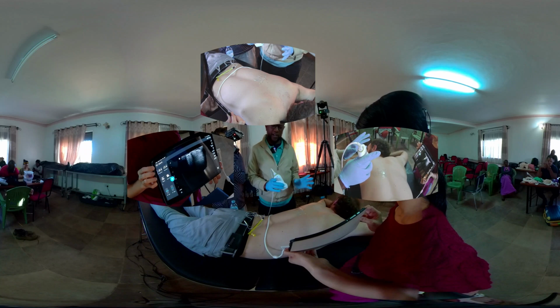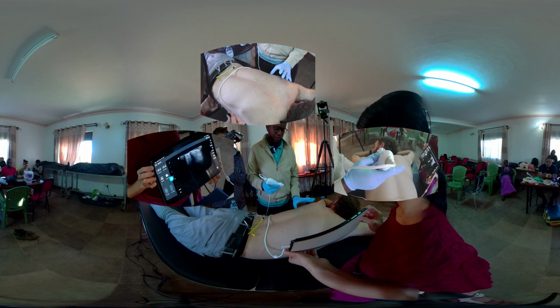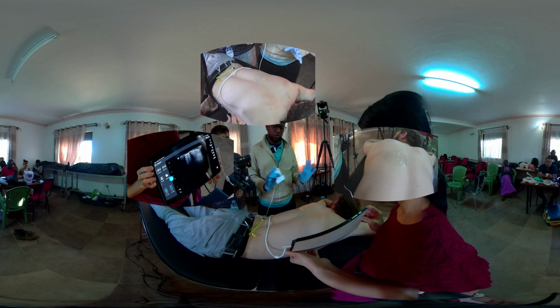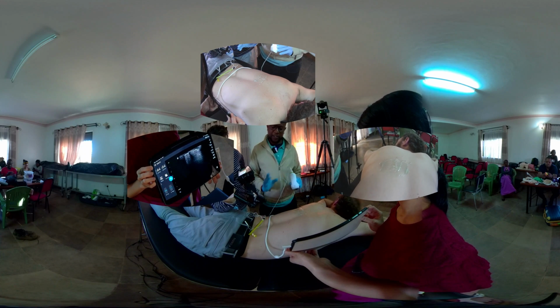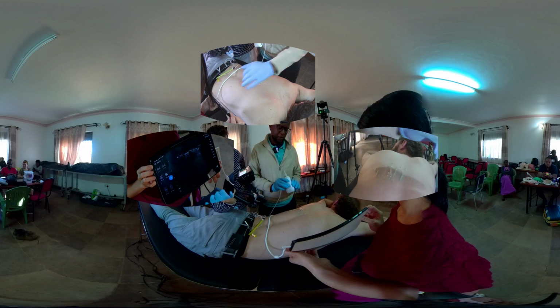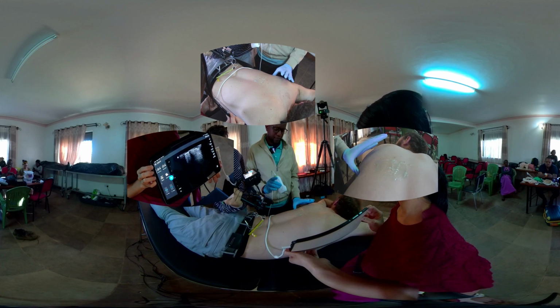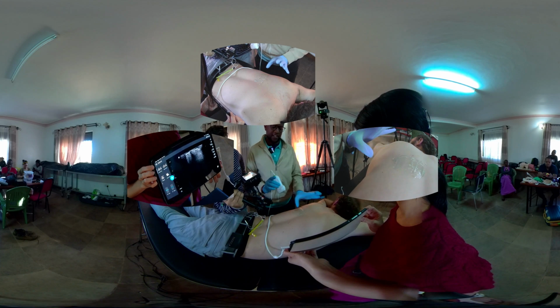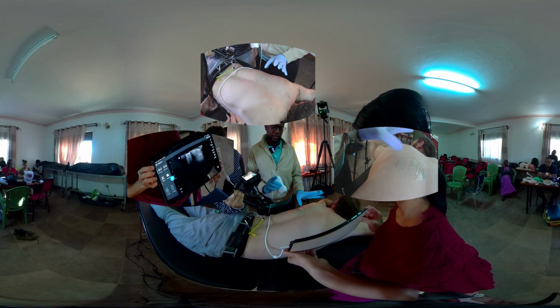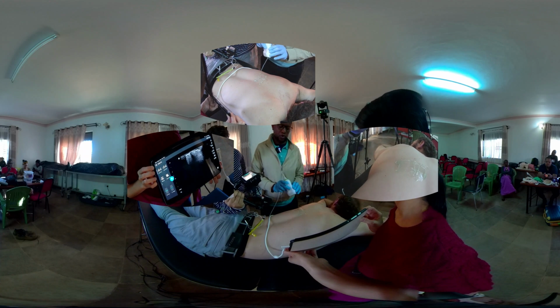So assuming that I'm doing this procedure for a breast surgery, I want to palpate the scapula, also assuming that all sterility has been observed and you've got the appropriate needle. You want to palpate for the lower border of the scapula and go medially. And that is approximately where you want to deposit most of your local anesthetic.